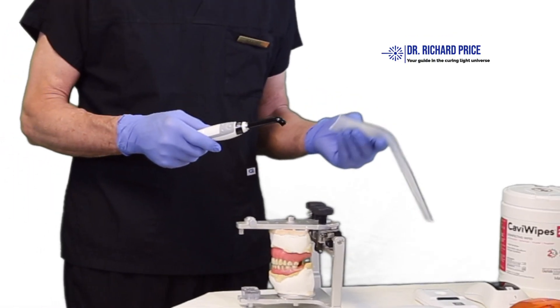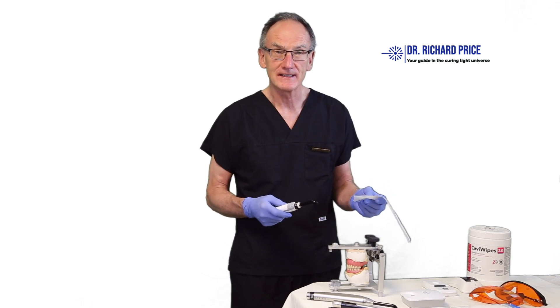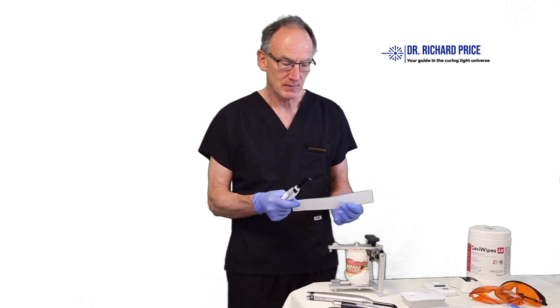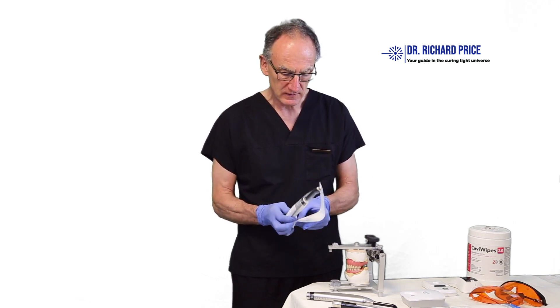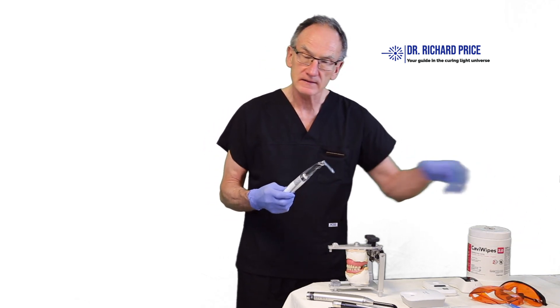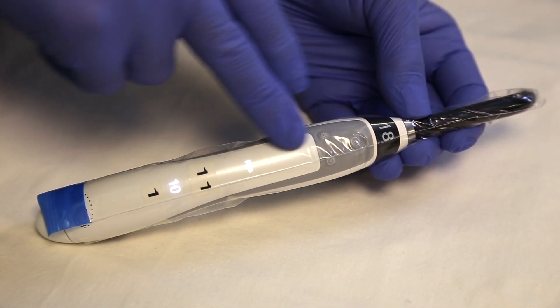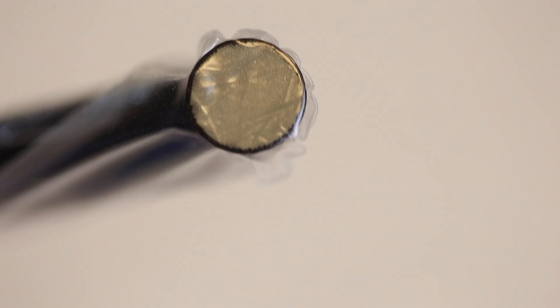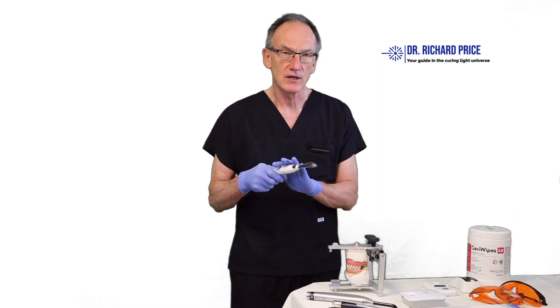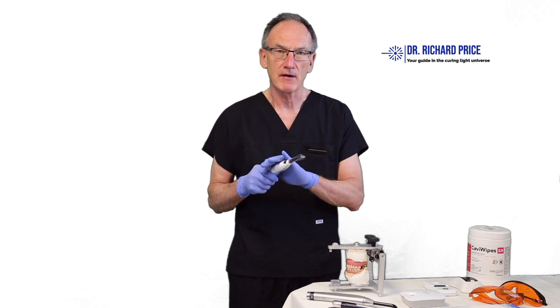After you've cleaned the curing light, inspected it, and confirmed it's working properly, the next thing to do is apply a barrier to the end of the curing light. Most manufacturers will provide a barrier that fits snugly over the end. Make sure there are no seams or wrinkles over the tip, because this will affect the light output. Once that's done, the curing light is ready to go.